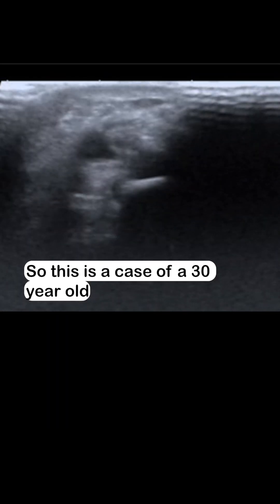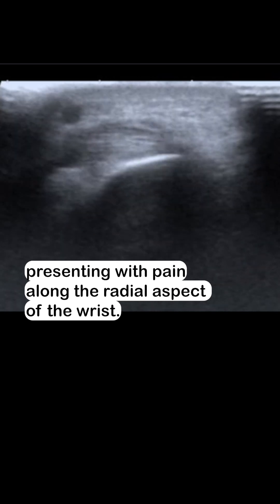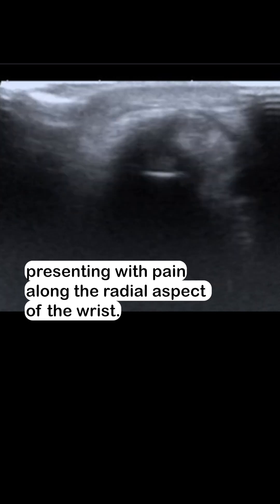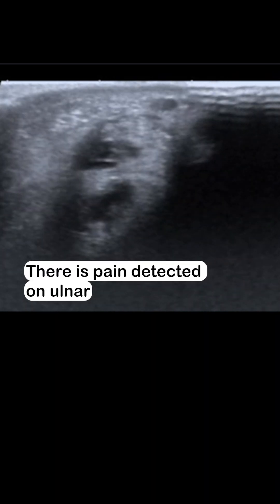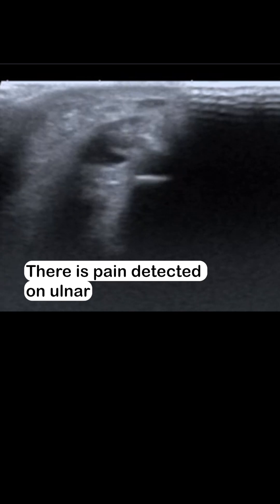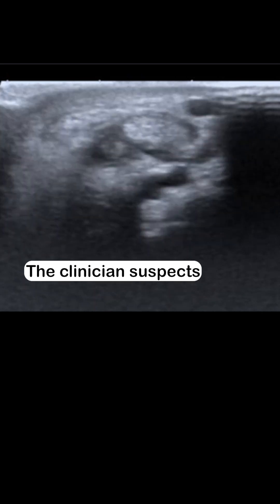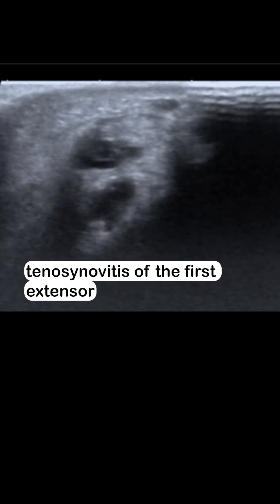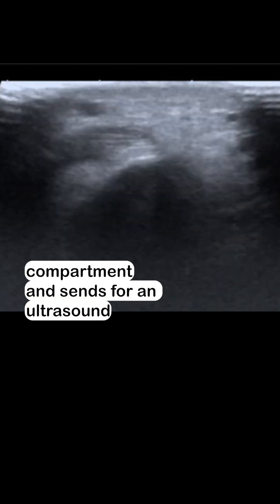This is a case of a 30-year-old presenting with pain along the radial aspect of the wrist. There is pain on ulnar deviation of the wrist. The clinician suspects tenosynovitis of the first extensor compartment and sends for an ultrasound.